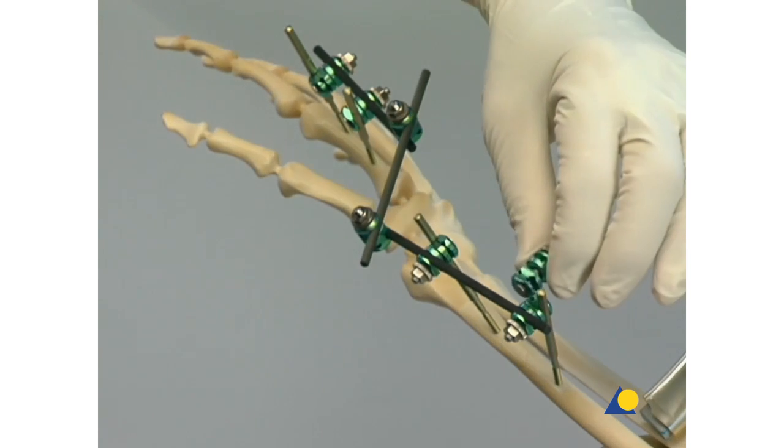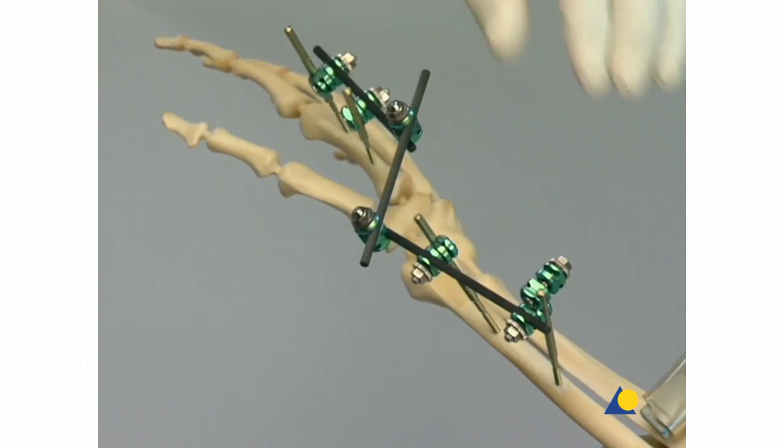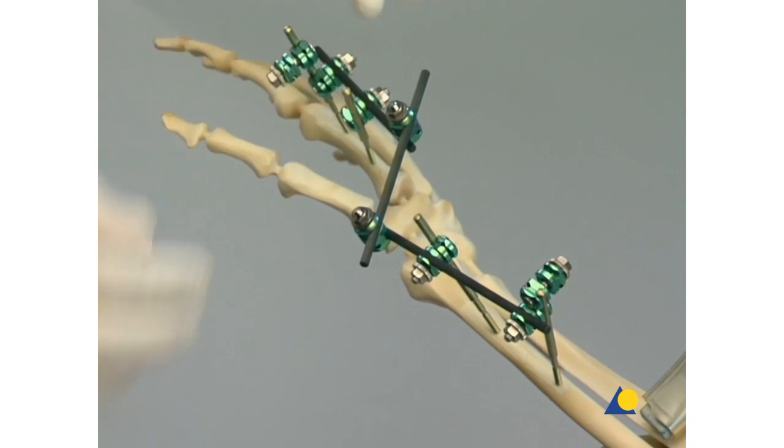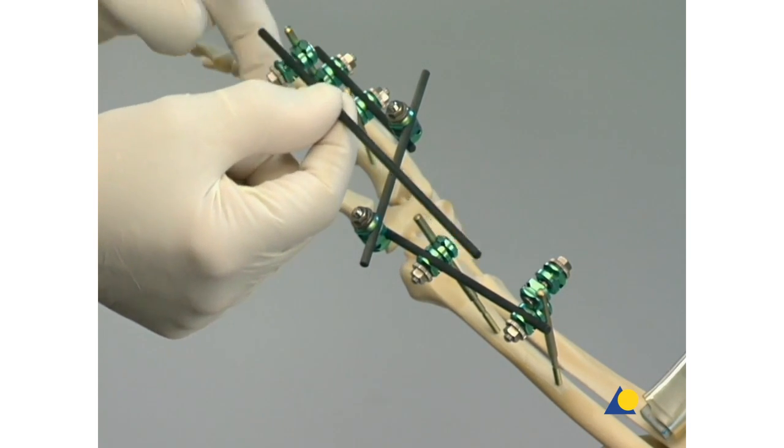Additional stability can be provided by a neutralization rod. It is sufficient to attach the rod to one Schanz screw in each main fragment.